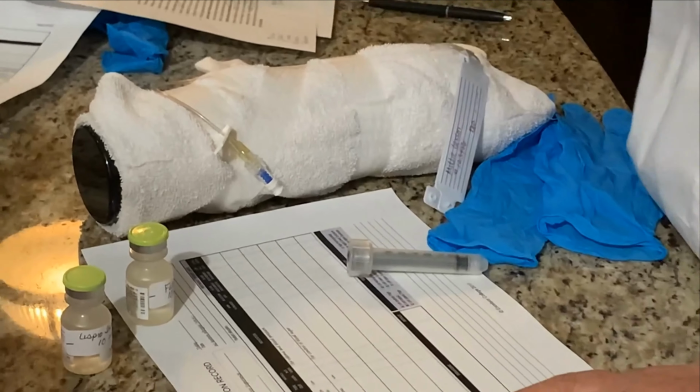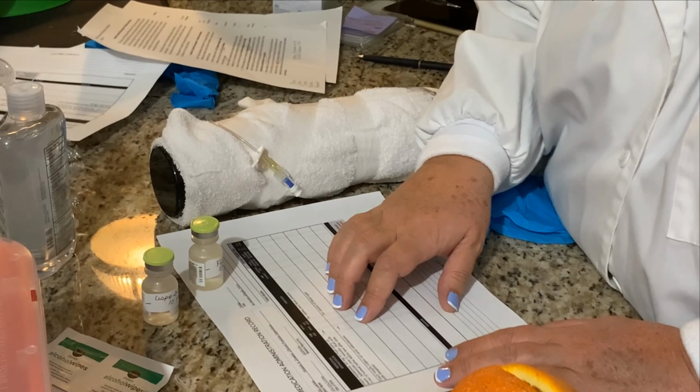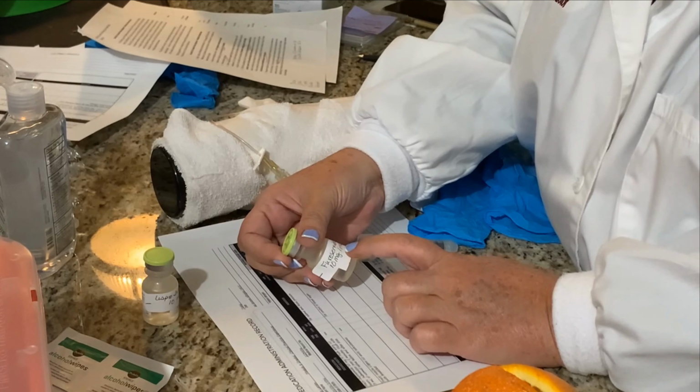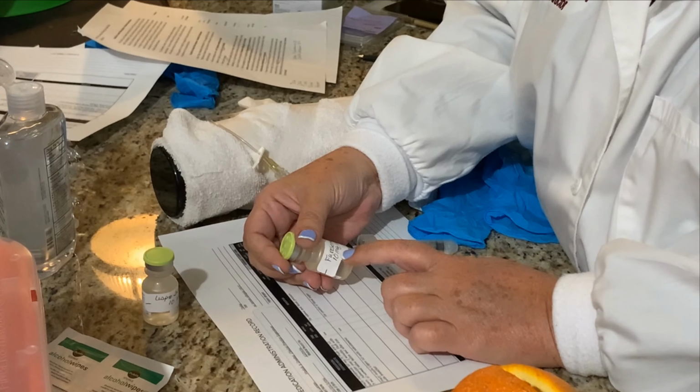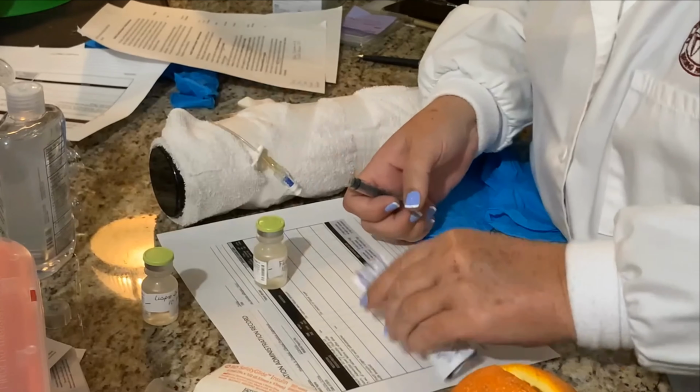I'm going to roll down the hall outside Millie's room, and I'm going to prepare the medication. This will be my second check. So as I'm preparing, I'm doing my second check. So the first one is furosemide, 20 milligrams IV push. I have furosemide 10 milligrams per ml. So I'm going to be drawing up 2 mLs. So I'm going to get my syringe and my needle. Remember, it doesn't matter what size needle that you have.